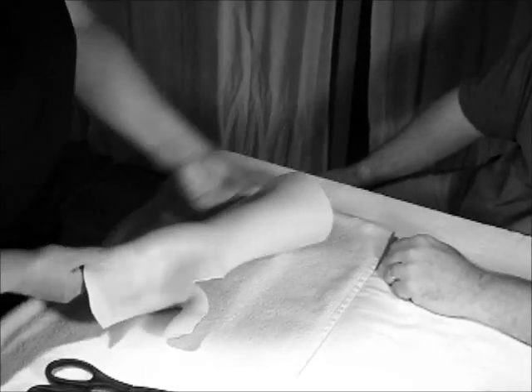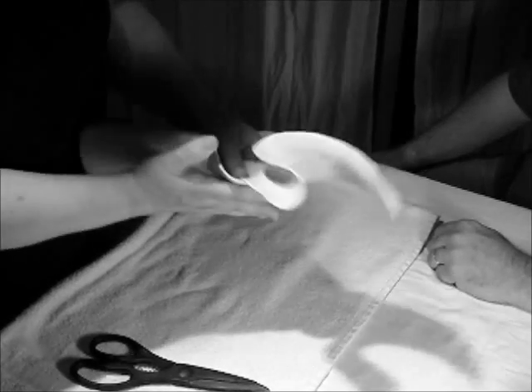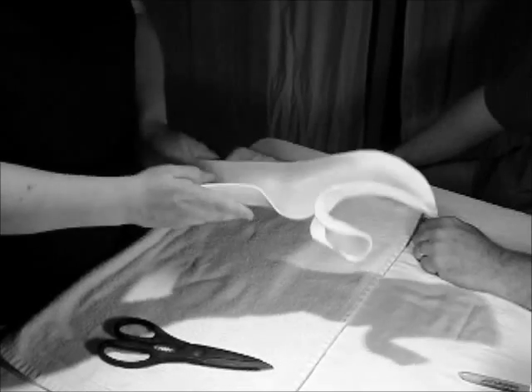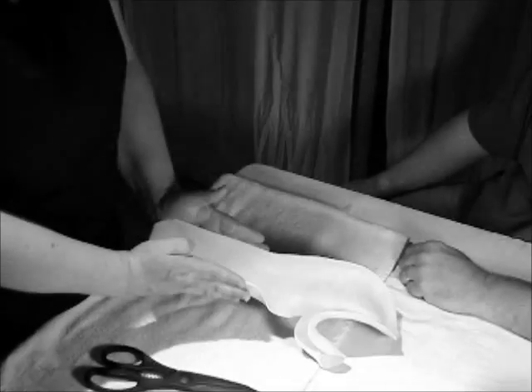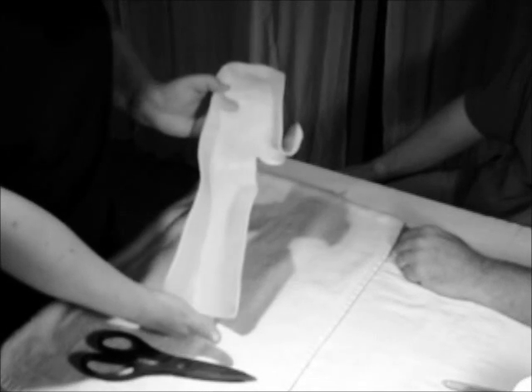And to finish the splint off, I would go ahead and trim this edge up, make that softer. And you might even, where he put this on his thumb, roll that back just a little bit. You don't necessarily have to do that. But then the patient themselves, they can either push this in or pull this out to make it more comfortable. And that's the resting hand splint.